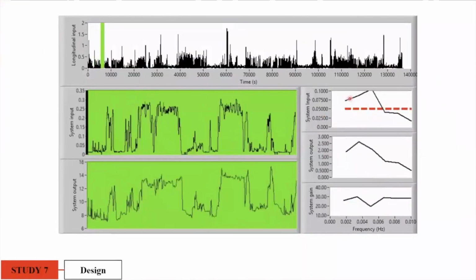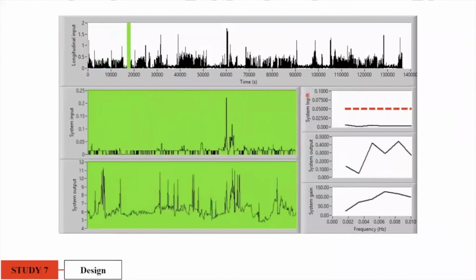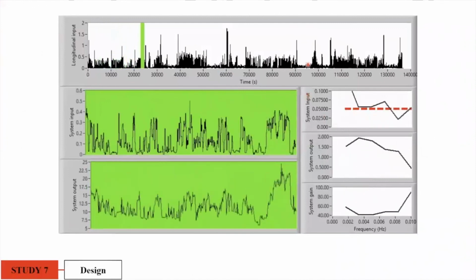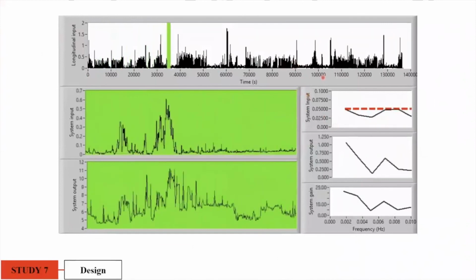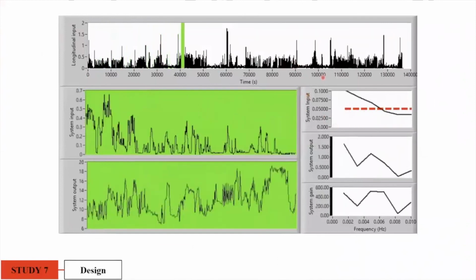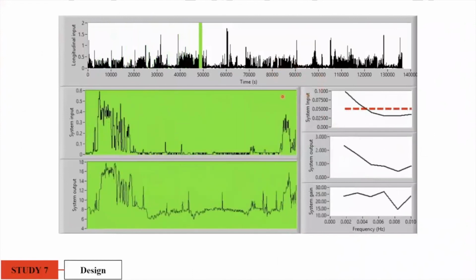And in order to extract the mean normalized gain, or the temporal characteristics of the VO2 response, from the random VO2 data, we built a computer program, also based on frequency domain analysis, that was able to mine the mean normalized gain from the estimated VO2 throughout the day. And here you can see the software working in real time.